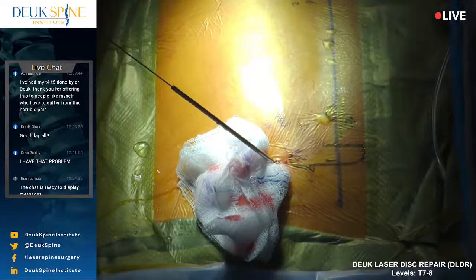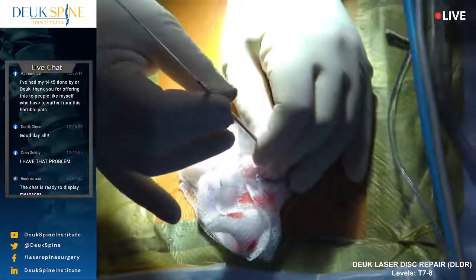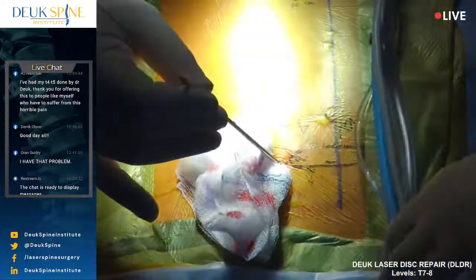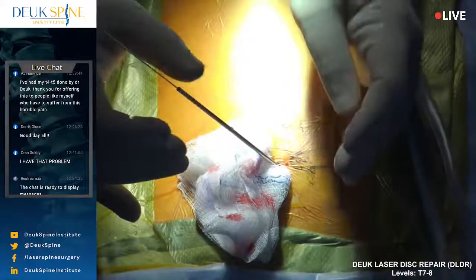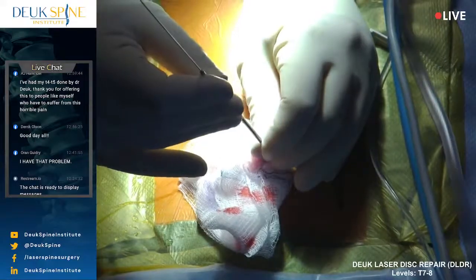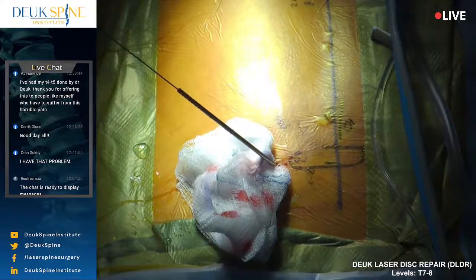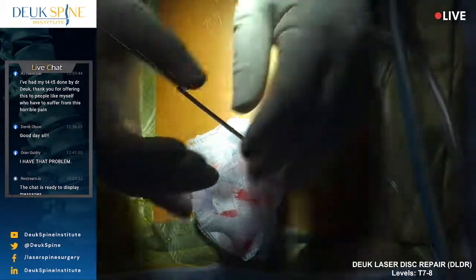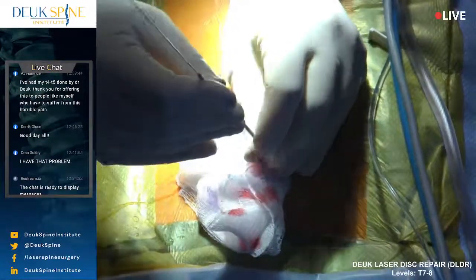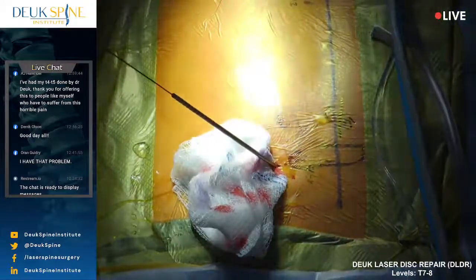It's quite incredible. So we are just to the side of the spinal cord right now. We're on the right side, and I'm coming down onto the herniation. I can actually feel it with the tip. And remember, the tip of my dilator is pushing things aside. It doesn't cut anything. That's one of the beauties of this procedure, we can fix things without cutting by just displacing. Of course, the laser itself is going to cut the annular tear and repair it, but right now I'm just displacing. Displacement means to move aside.